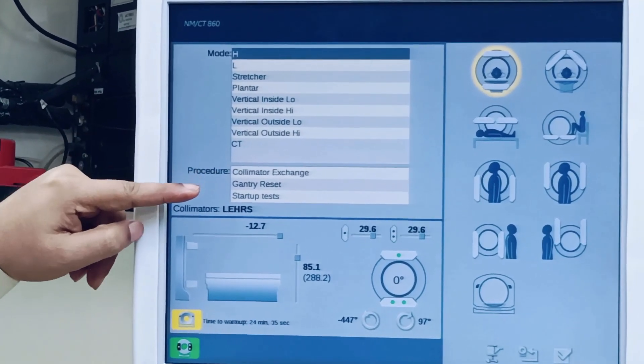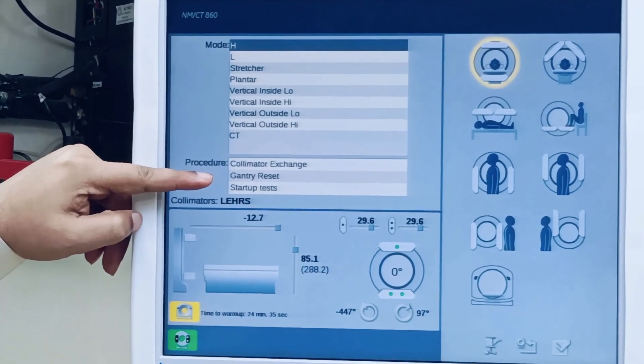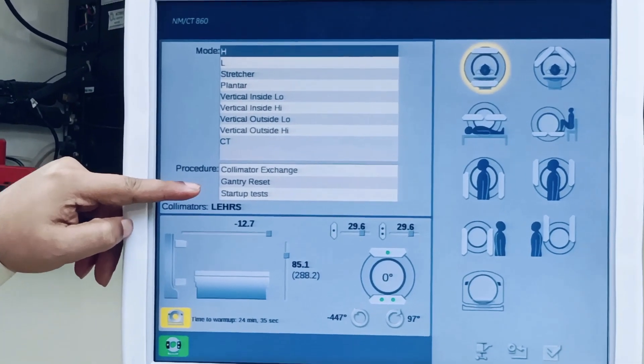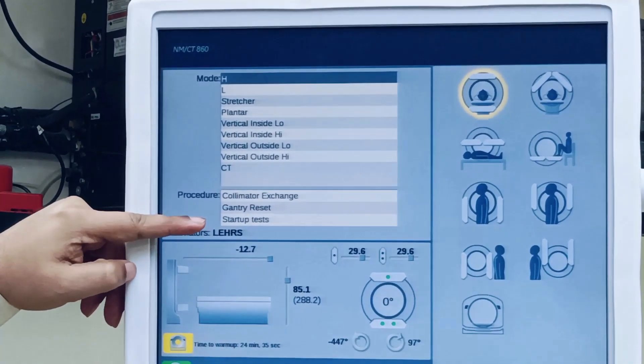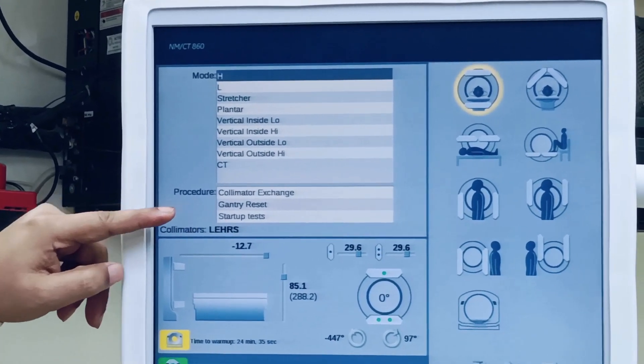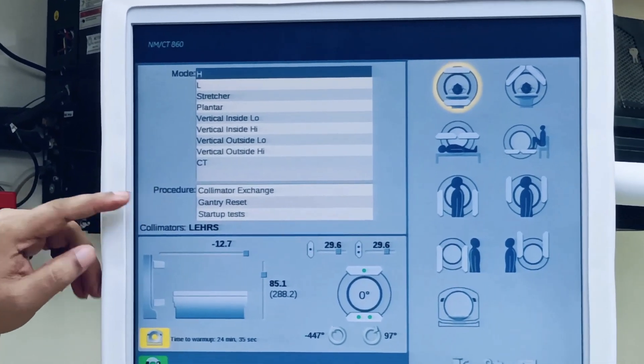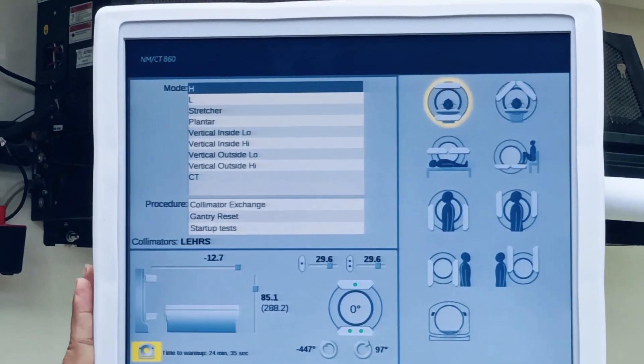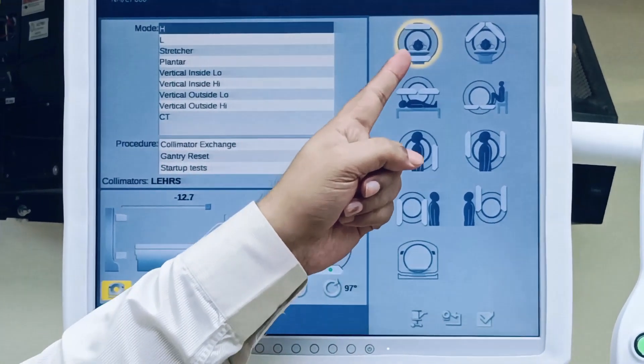Other options include collimator exchange, gantry reset, and morning startup test. All these modes are available here.